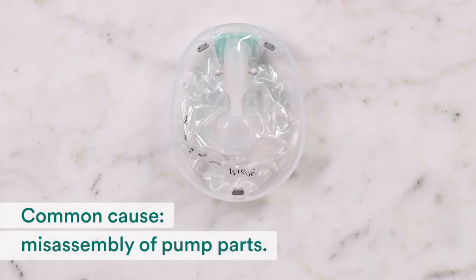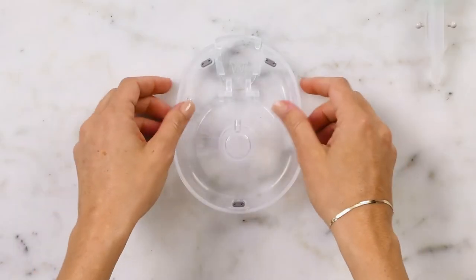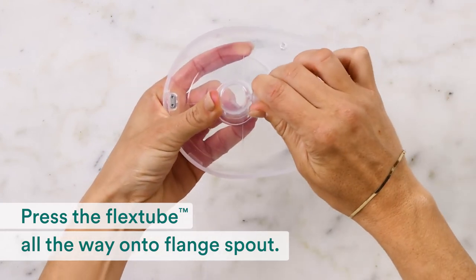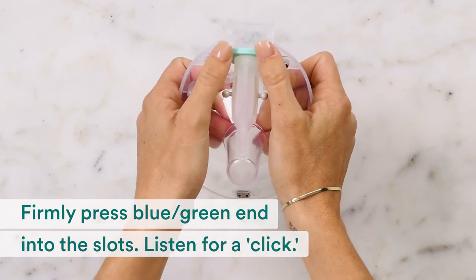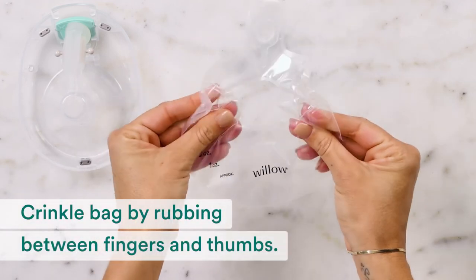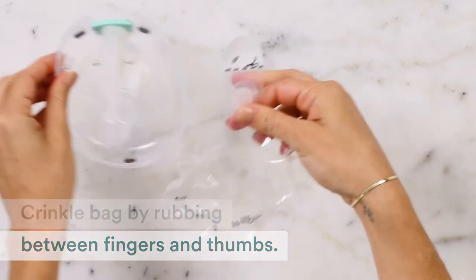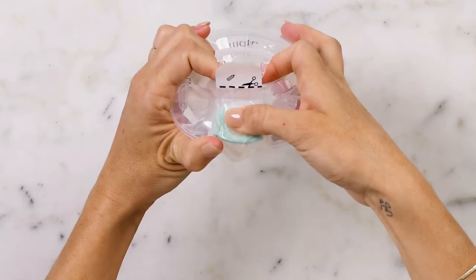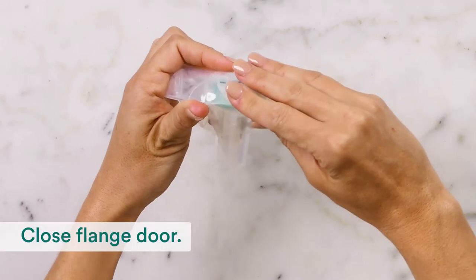Another common cause for an orange blinking light is misassembly of pump parts. When assembling, make sure you press the flex tube all the way onto the flange spout, and firmly press the blue-green end into the slots — you'll hear an audible click. To make the bag easier to assemble, you can crinkle the bag between your fingers and thumbs. Press the valve firmly against the flex tube. Smooth over the milk bag so it's snug against the flex tube, then close the flange door.